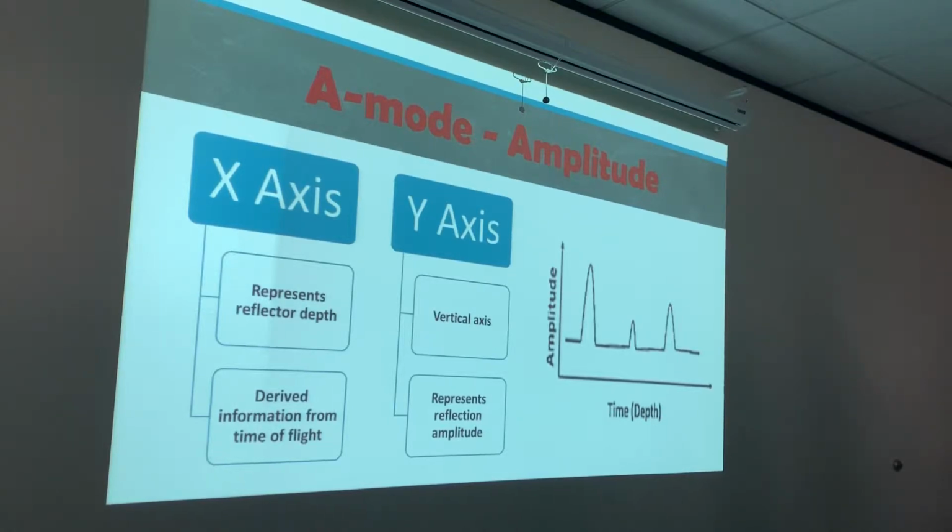We can say here time of flight, time and depth. See, I have it right there. Yes, ma'am, you sure can. Because remember, when we're talking about time of flight, we're actually determining how deep a structure is within the body. And remember, based on our 13 microsecond rule, we can determine how far it has traveled and the time it took to travel that distance. So definitely, we're using both the time and the depth.